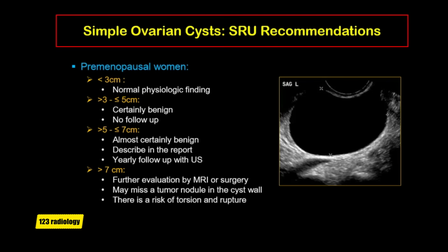Because when it gets so large, it can be hard to completely scan the cyst wall, and you may miss a tumor nodule in the cyst wall. There is also a risk of torsion and rupture.